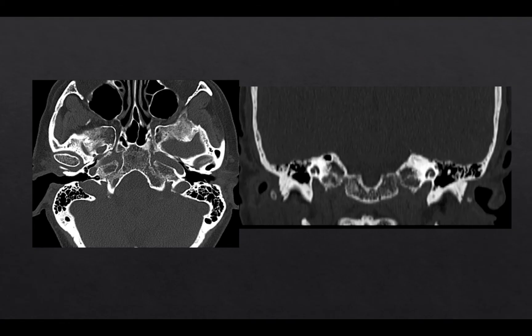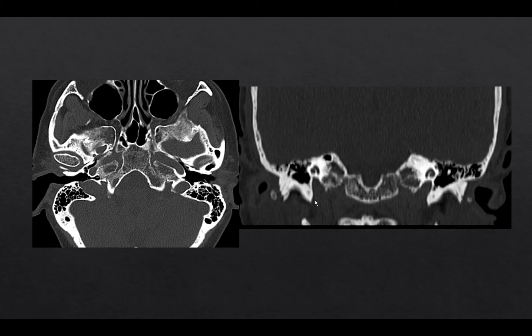Let's highlight a few key anatomic points on CT. Centrally we have the clivus, then the petroclival fissure of the petrous bone, and then the jugular foramen, often larger on the right side. You can see how closely related the jugular foramen can be with the middle ear, and how easily the jugular bulb could become dehiscent into the middle ear on the coronal image. We can also imagine how an arteriovenous fistula with the sigmoid sinus would result in pulsatile tinnitus.